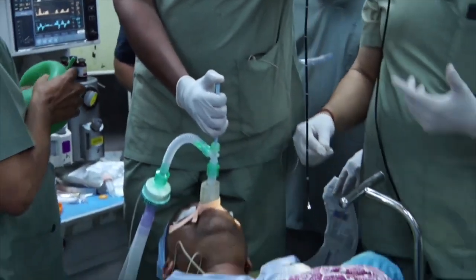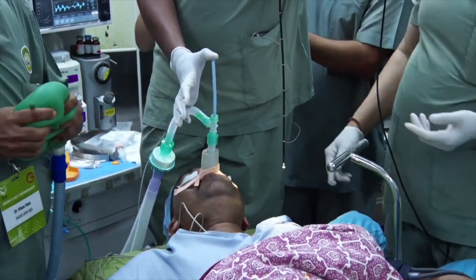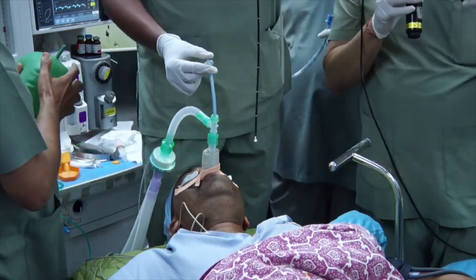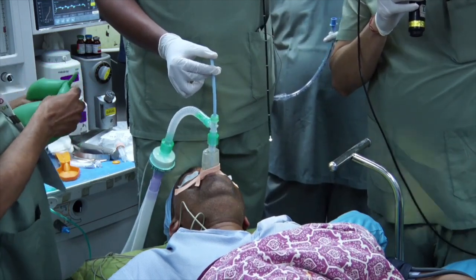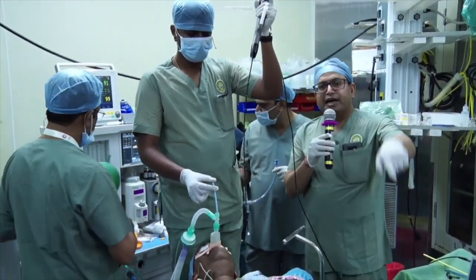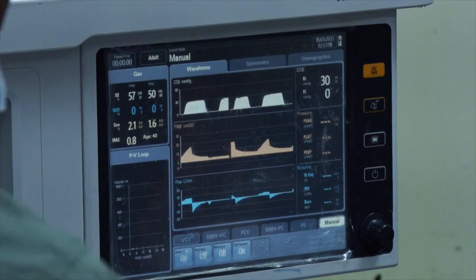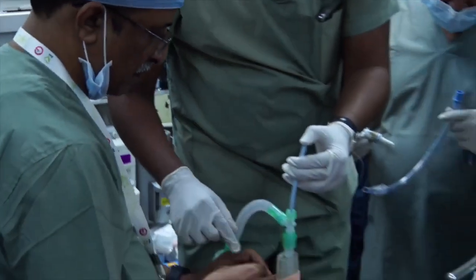You're able to oxygenate. You're getting quite a good tidal volume even with the Aintree catheter, but the pressure goes up. The reason you don't get end-tidal CO2 is the gases cannot come out through the small tube — it's too small a diameter, they come out from the side. You will see the airway pressure changes. The patient is breathing spontaneously. Once you see reduction in tidal volumes, you can go for it — disconnect the tube.